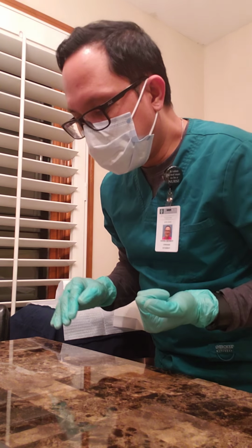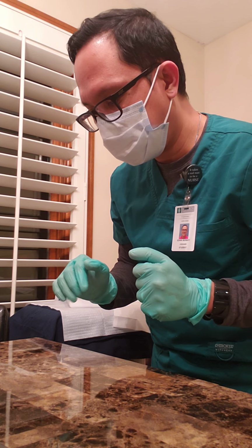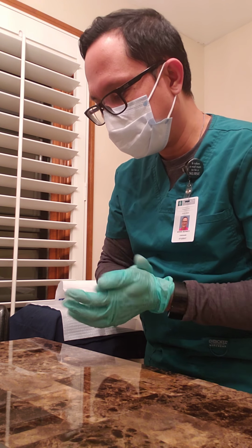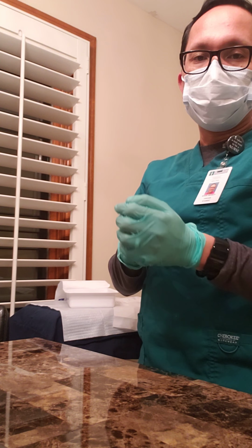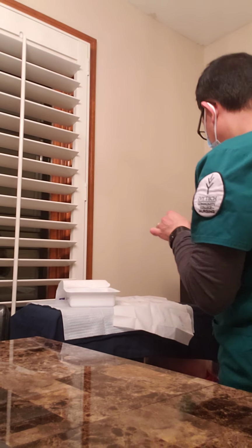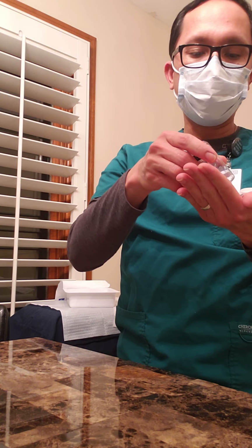Alright, after that, you might want to just take a look at the side and check for any irregularities, tenderness, swelling. If there's none, now you can take your gloves off, put them in the receptacle and do some hand hygiene.